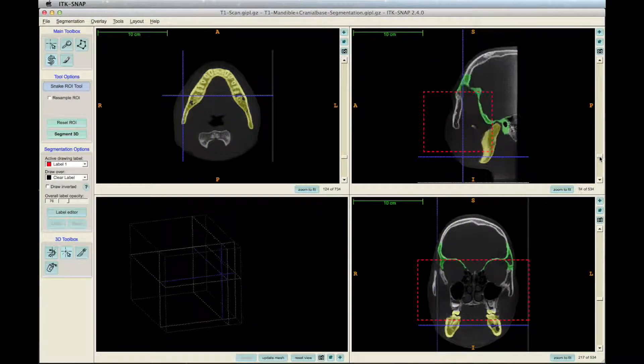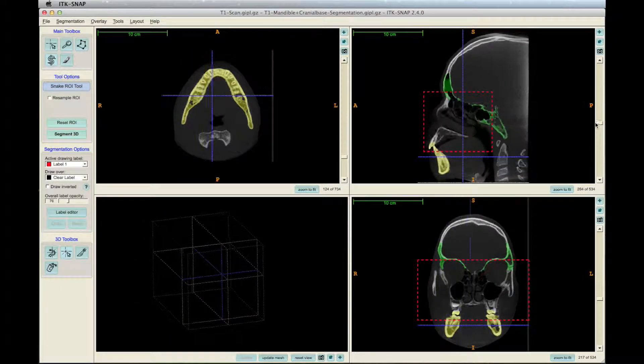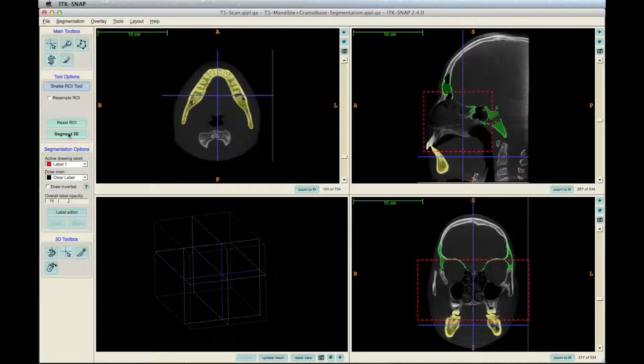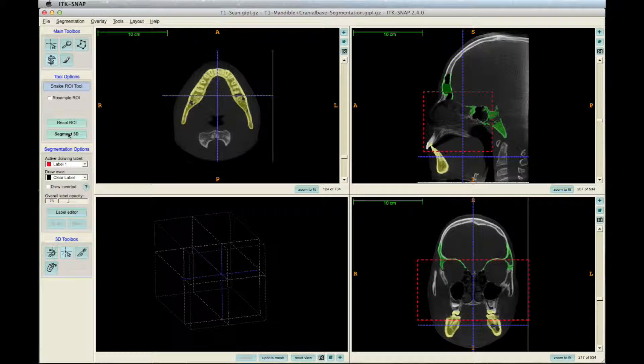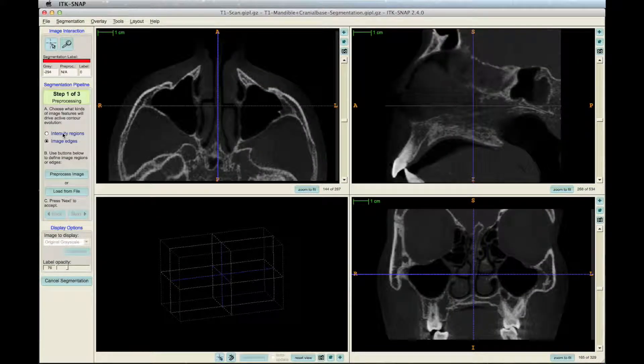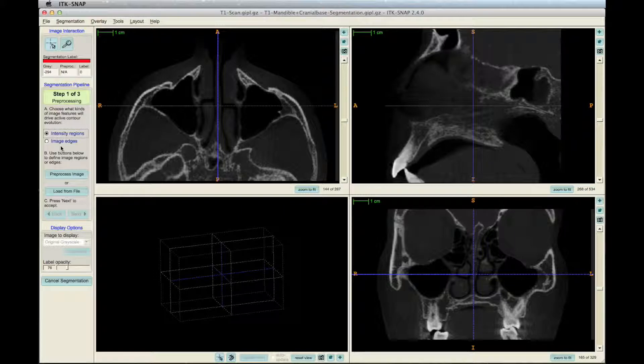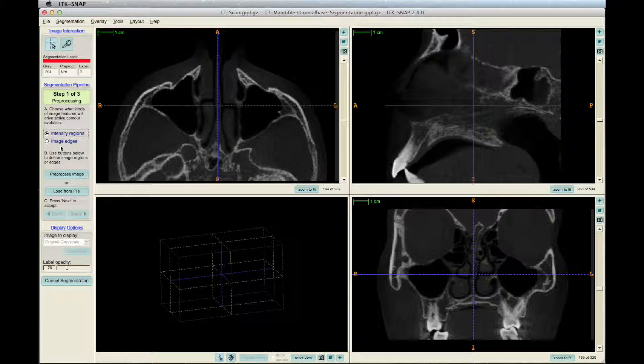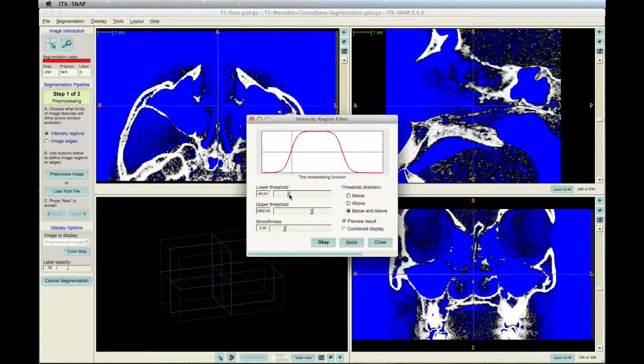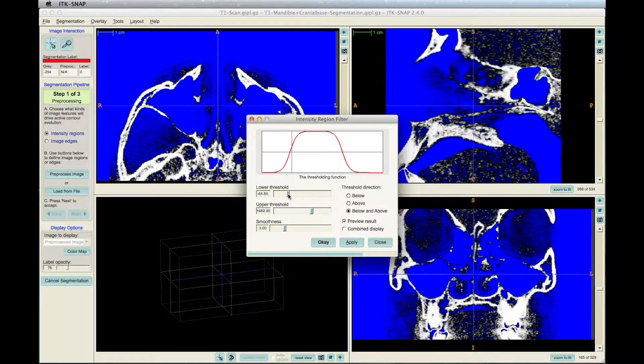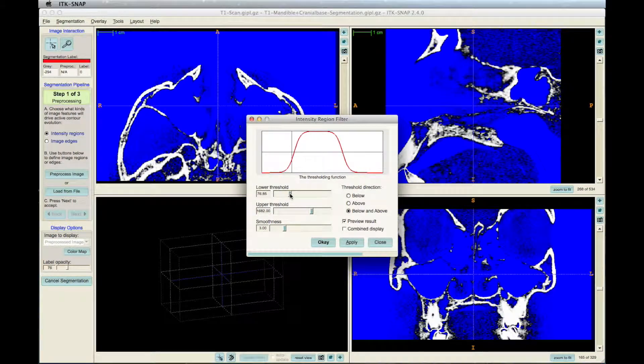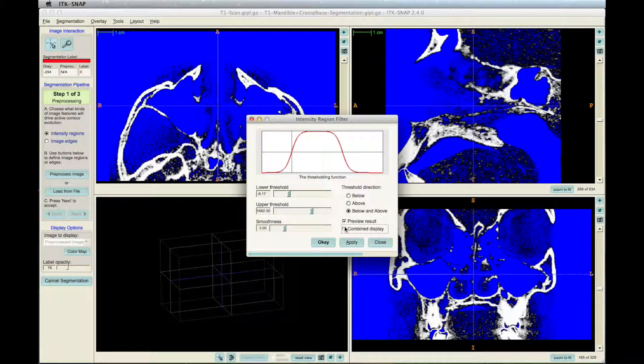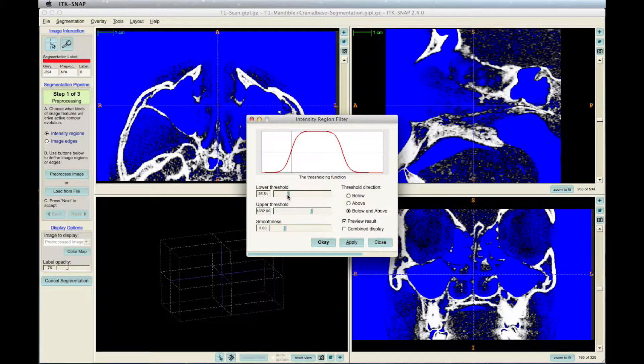When finished, click segment 3D on the left toolbar. The next step is to choose between intensity regions, which is used to start segmentation from zero, and image edges, which is used when the segmentation is already done and you need to make some retouches. Click preprocess image. Try to adjust the lower and upper threshold so that the bone gets visibly white without excess noise.